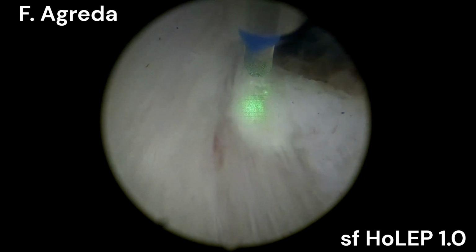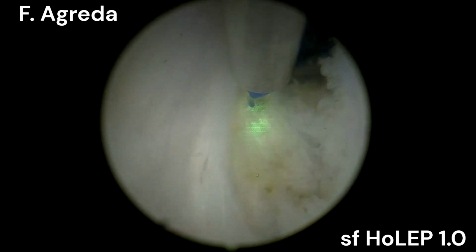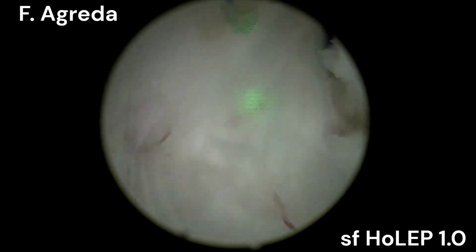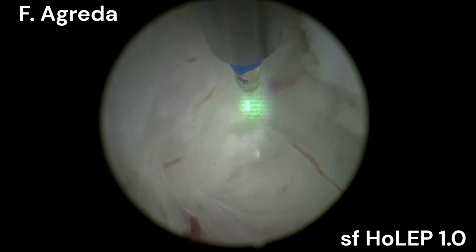Same process for the right lobe. We progress from lateral to medial, from 9 hours to 6 hours. Here you can see the prostatic arteria.